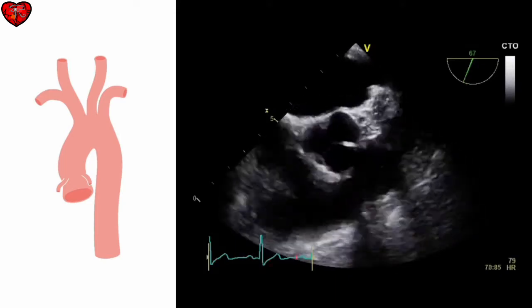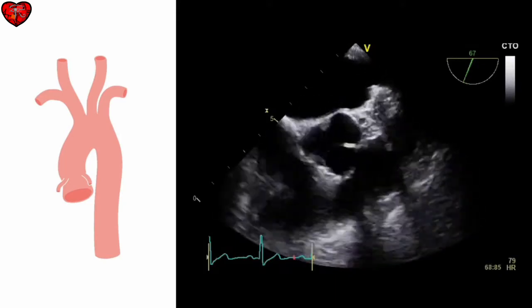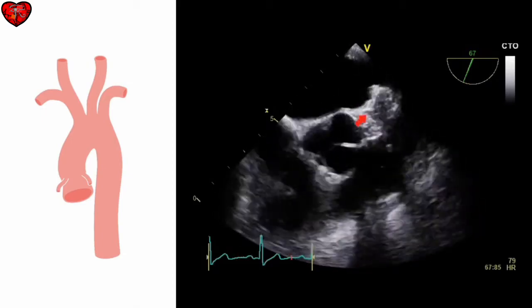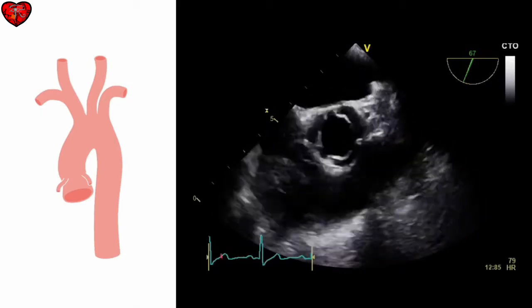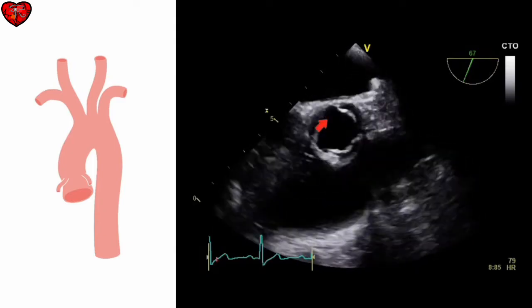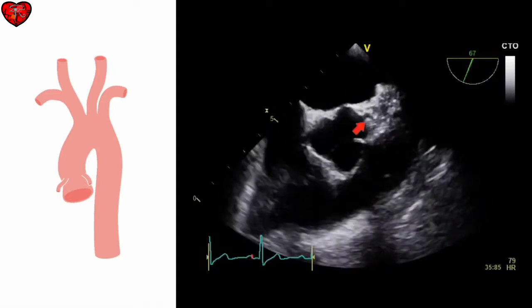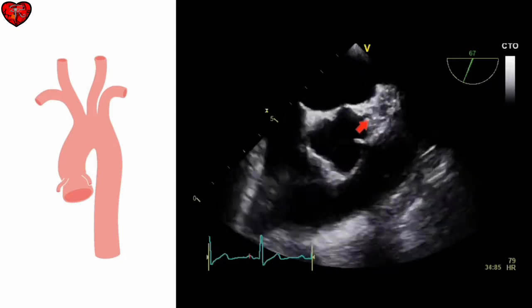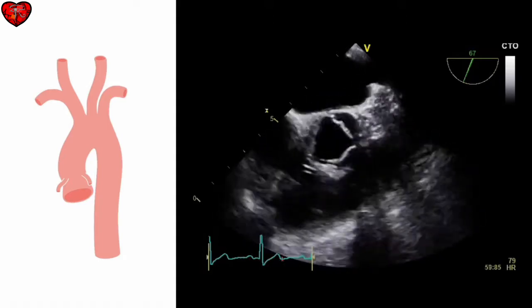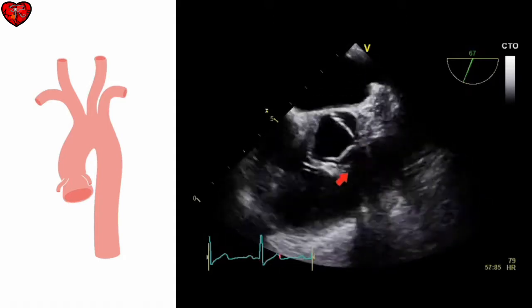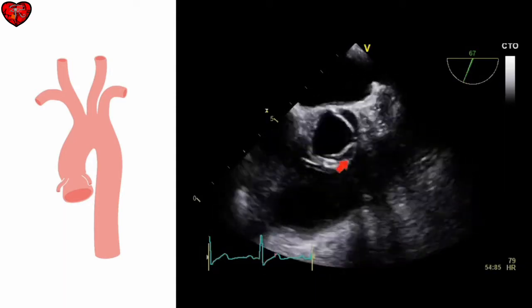We can examine the aorta in both long axis and short axis views. This is a short axis view just at the level of the aortic valve, and we can see the three sinuses of Valsalva: the non-coronary sinus, the right coronary sinus, and the left coronary sinus of Valsalva. Arising just at the edge of the left coronary sinus is the left main stem — that is, the proximal part of the left coronary artery. By manipulating the probe, we can also often bring the ostium of the right coronary artery into view.